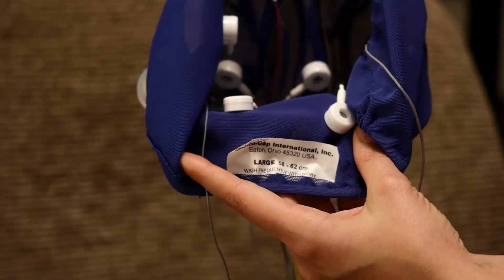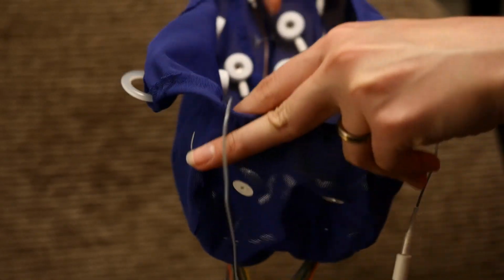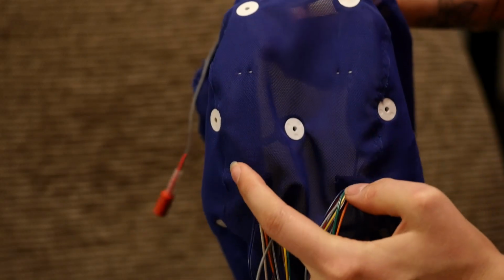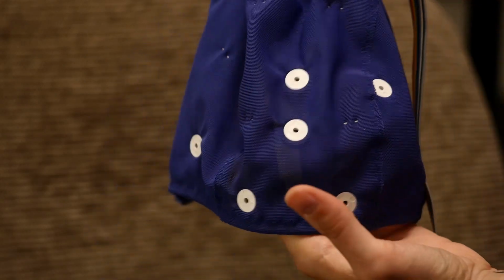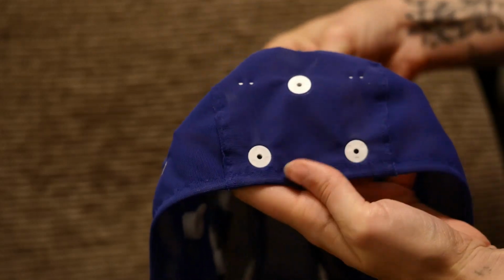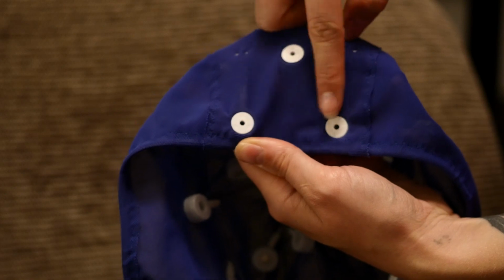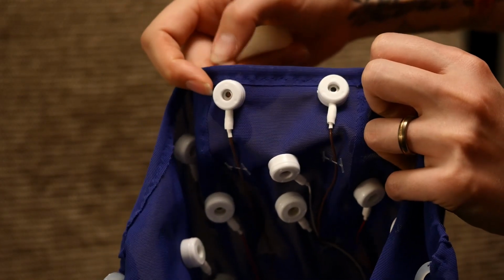All right, so here we can see the back of our cap. That's where this little tag is located, at the back. If we follow it along the top of the cap here, there's our zenith midline region, and follow it all the way to the front of the cap. So this is our forehead, and these are the FP1 and FP2 sites. Those are going to be right above our eyebrows, and we're going to want to put our sponge discs onto those two electrodes.